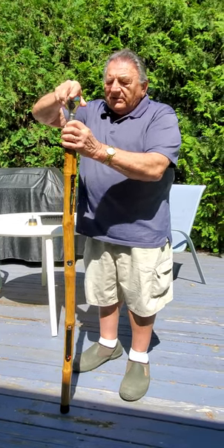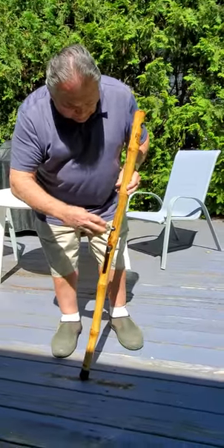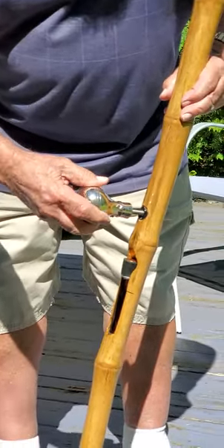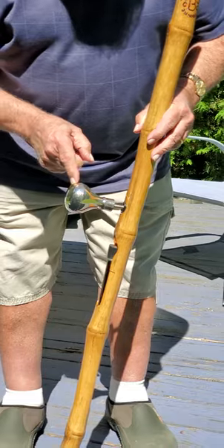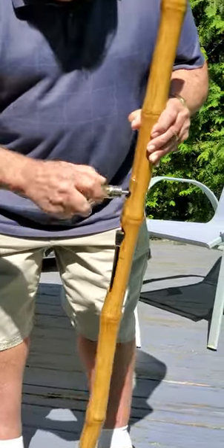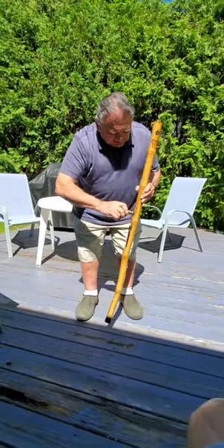We unscrew this one from the top, which is interchangeable with the other one, and it's going to go in here, down here, and it'll go all the way through. It has a bolt going all the way from where my finger is, all the way through to the other side of this cane to give it a lot of strength. Put that on, snug it up, like so.